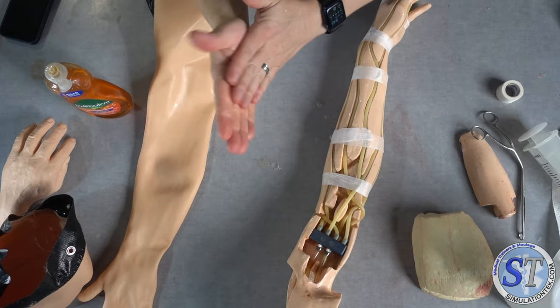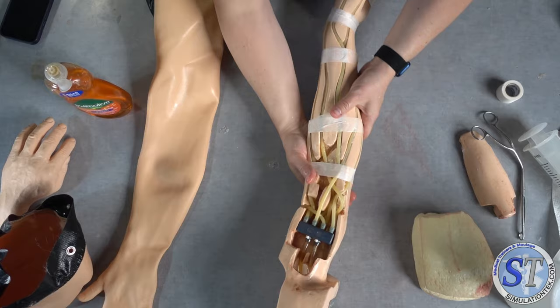I've got my skin prepped. Now, same thing with the arm, just soap it up. Just get some good soap in your hands and soap it on up. Now I'm gonna stay away from the places that I've gotta put the plugs back into. I'm mainly concerned with the wrist, the fingertips, and the forearms.